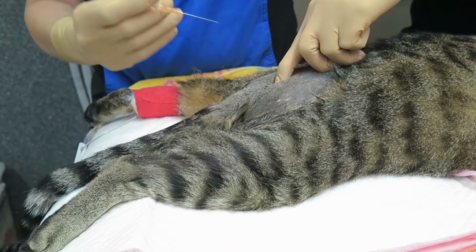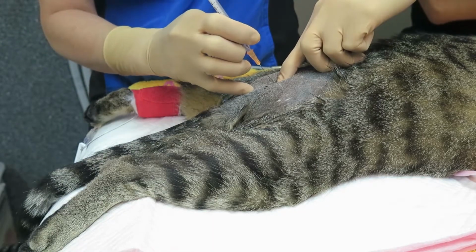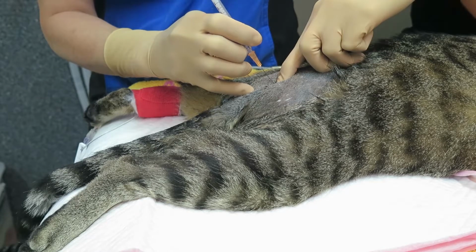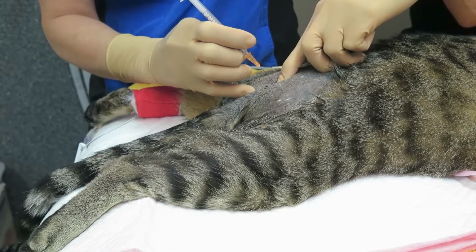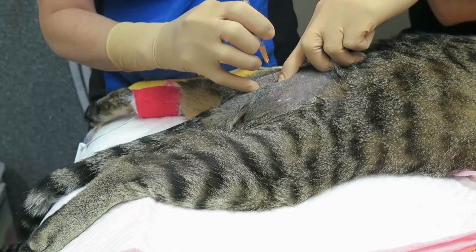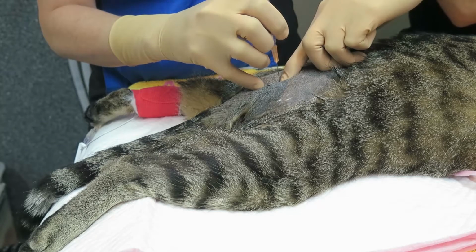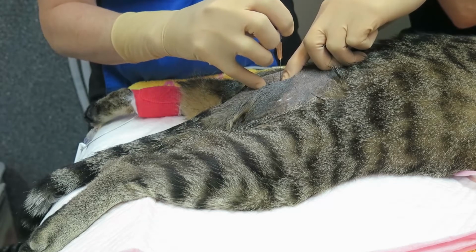So what we do is we use a 25 gauge needle that's 1.5 inch, and within that 1 ml syringe is basically 0.22 mg per kilo of bupivacaine. And that typically works out between 0.2 to 0.3 mls per cat.